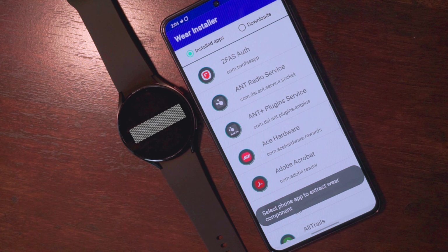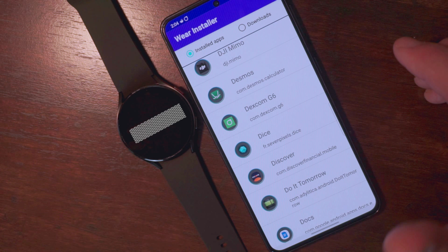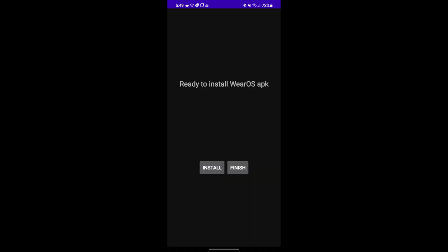Scroll down to the Dexcom G6 app and then click on it. It'll prompt you to check your watch and accept the connection request from your watch. Click OK, and then it should prompt you to allow debugging. Wear Installer will now send the Dexcom APK, or Android Package Kit, to your watch. Then Wear Installer will start ADB, which is an Android Debug Bridge. When prompted, you will accept connection and install.